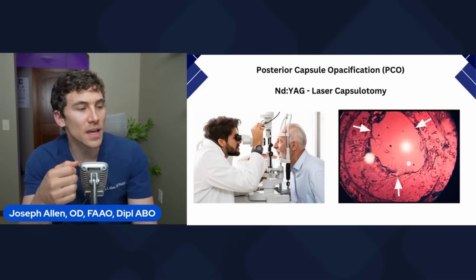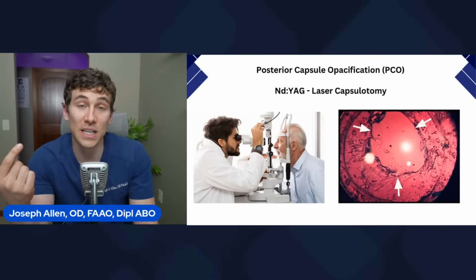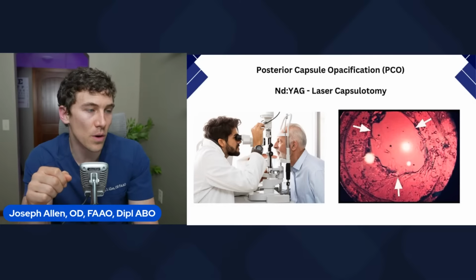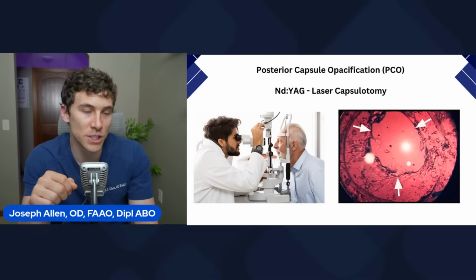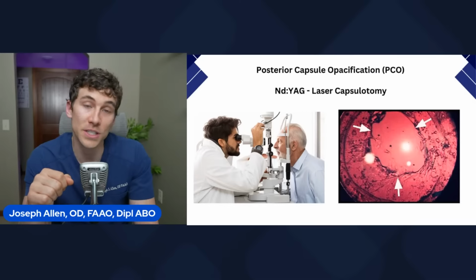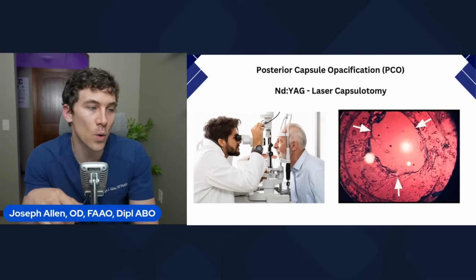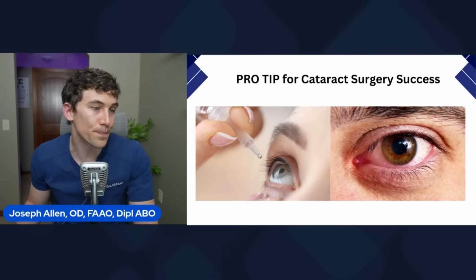This is a procedure that I was trained on as an optometrist back in 2013, 2014 when I was in school, and I still hold a certification for it and get retrained on it frequently. So it's a great procedure. Depending on the state you live in, your optometrist or whoever's doing your primary care may be able to do this procedure for you. Otherwise, they will often refer you back to the surgeon that did the cataract surgery, or another qualified surgeon in your area, to do this laser treatment.